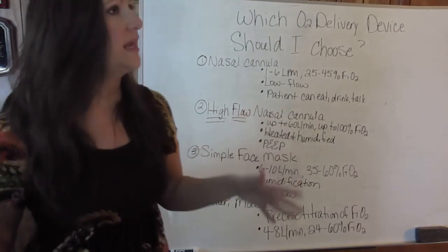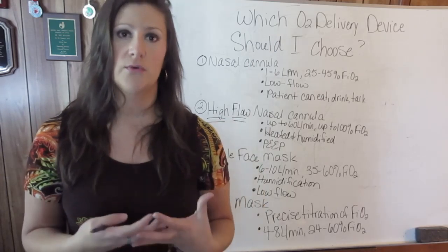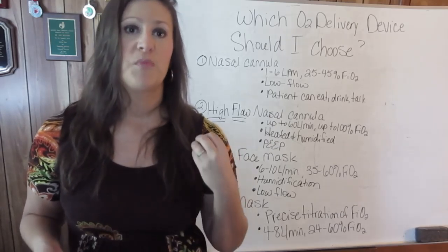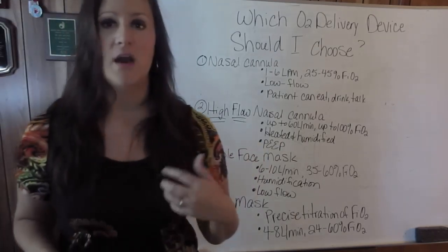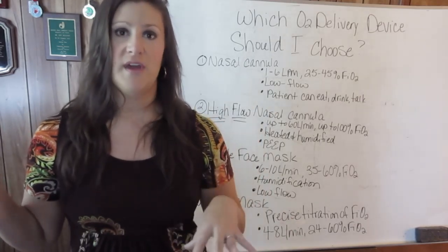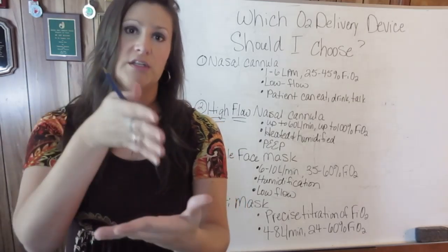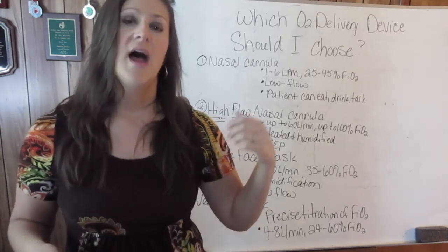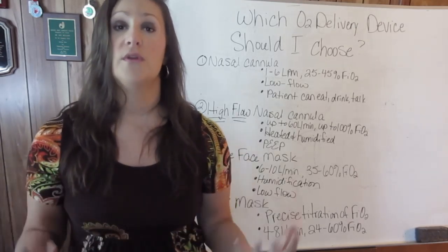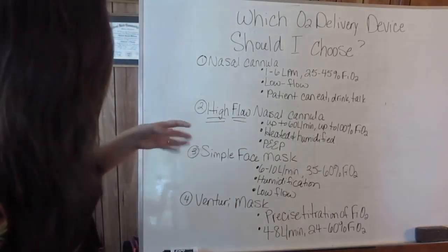But the high flow nasal cannula is gaining a lot of traction and a lot of attention as far as being useful for COPD patients. And the reason is that a high-flow nasal cannula can apply a PEEP effect. And now we know PEEP is positive end-expiratory pressure. So that PEEP effect keeps the alveoli open at the end of expiration by continuing to apply pressure. And so in that way, a high-flow nasal cannula is going to assist with ventilation, is going to assist with removal of CO2, and we know with our COPD patients that is huge, right? So that's what a high flow nasal cannula is.